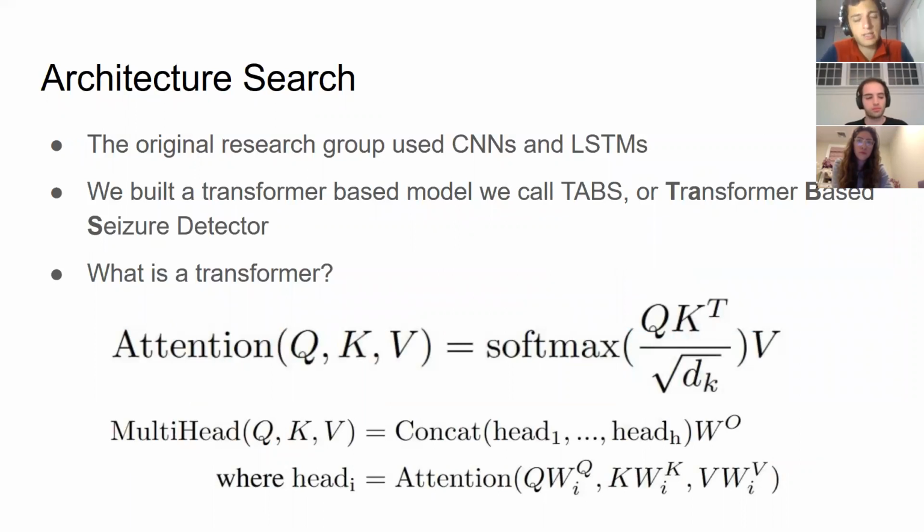Yeah, so as Guy talked about, their model consisted of pre- and post-processing stages that were not deep learning, right? The pre-processing stage consisted of multi-rate filter banks, and then the post-processing stage consisted of linear regression or polynomial regression, whatever it was, and a bunch of other things. But in the middle, what they had was a CNN and LSTM, the idea being taking context. So you have a window of the EEG, and the LSTM allows you to take into consideration some history of what happened before. And then the CNN allows you to look at a region. It gives you some spatial awareness, which is important for a signal, for being able to detect the seizure.